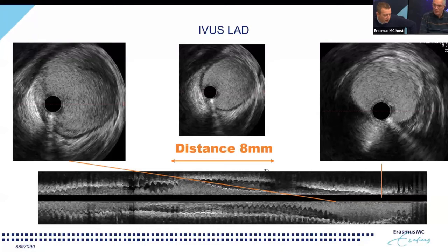Having a patient that was hemodynamically stable, had a LAD and left main that were at all occasions, from a luminal perspective, patent. And we had two pathologies that were not necessarily related, but in theory, obviously could have been related.